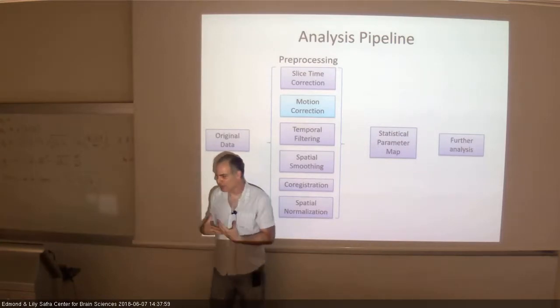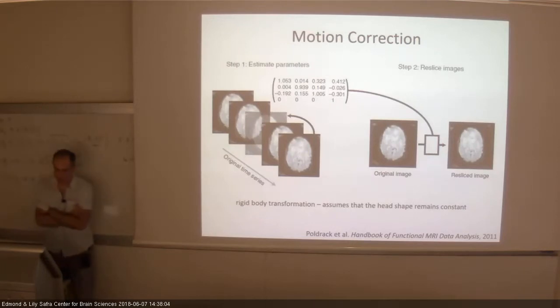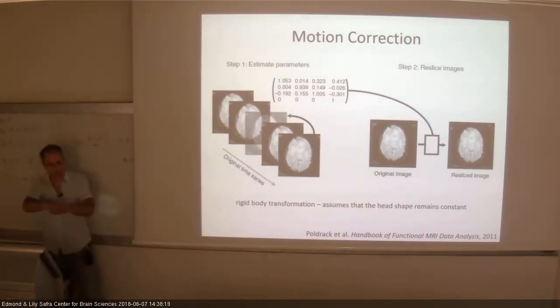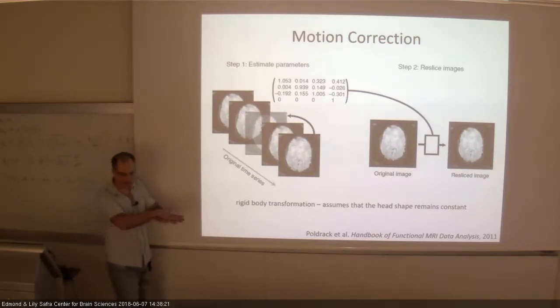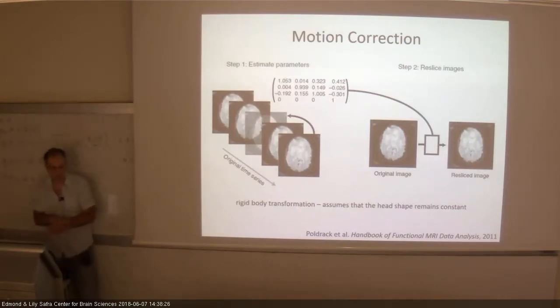Anyway, so that's one thing. But getting back into business, we now have pretty standard algorithms that take into account the motion. Basically, they sample the image you get at every time point, and they can detect changes in the intensities. They correct for most of the head motion.